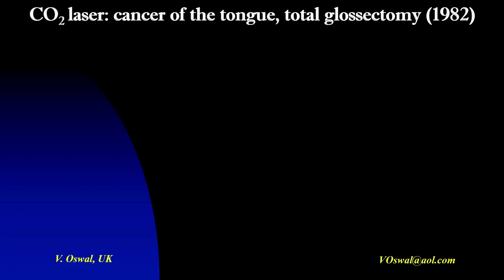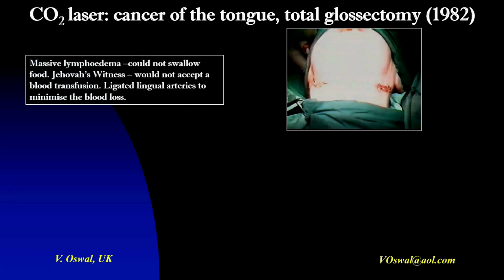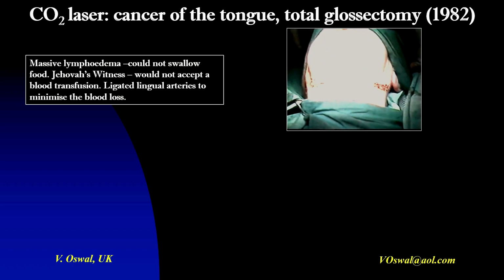After a successful partial glossectomy, I used the laser for transoral total glossectomy. This patient developed massive lymphedema due to radiation, and she could not swallow food. As a Jehovah's Witness, the patient refused transfusion, so I ligated her lingual arteries to minimize the blood loss.